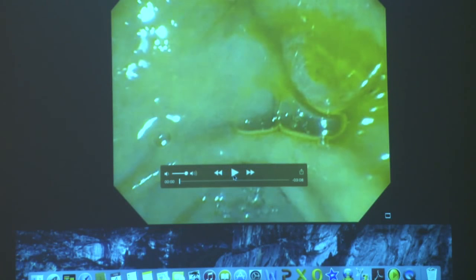It's the same case — you can see the wire going in smoothly. There is that wire now, but it doesn't look like it's in the duct. It went very smoothly, yet I don't see contrast in there. If I keep pushing, I'm going to end up either in the dorsal duct — which is likely the case — or in a side branch. When that happens, stop and do not keep pushing.